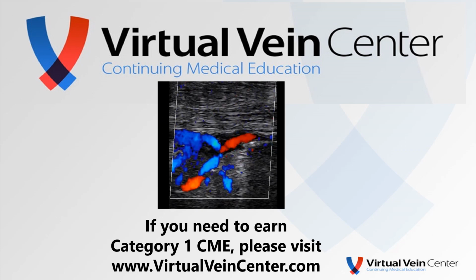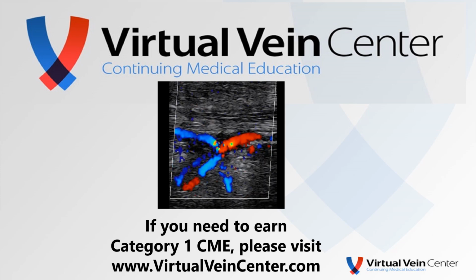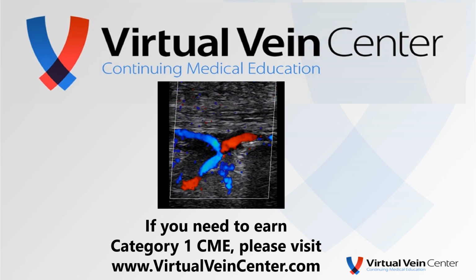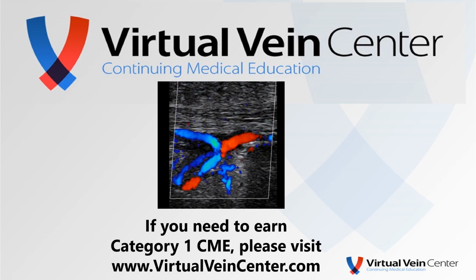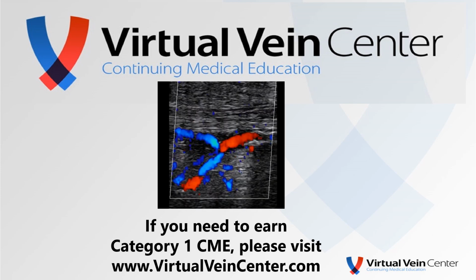So how about that? That one little collateral supplying the entire lower leg and the foot. However, obviously not enough collateral flow. Actually, I was not able to take toe pressures on this individual. PPG wouldn't work, too much motion, as well as the ulceration on the toe. The ankle pressure was about 40. Certainly, this is ischemic ulceration.